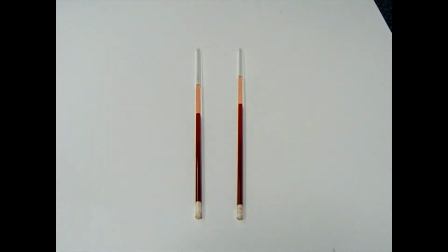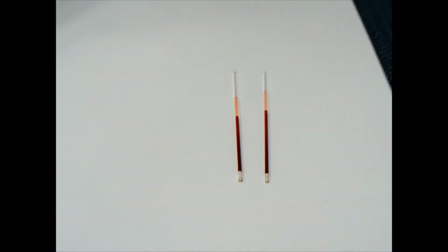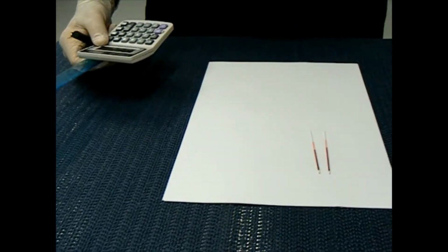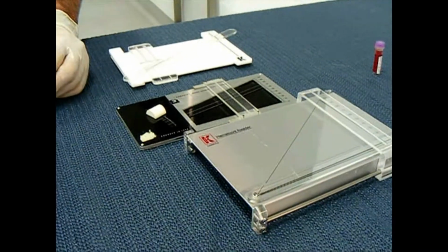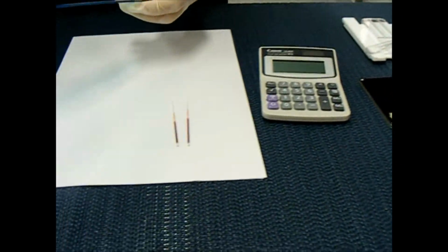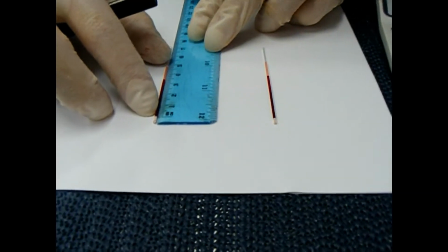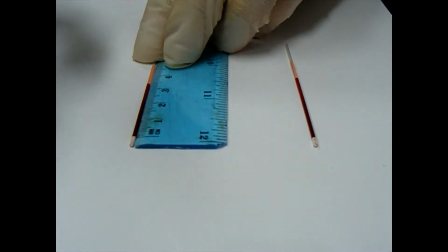We need to do a PCV in 2 ways. One is by using a ruler and a calculator. This is a manual method, so everyone needs to know how to do this way. We've also got some readers here, so you need to be able to use a reader. I'm going to show you how to do both those methods. Okay, so if we've got a capillary tube like this, you need to measure. Then there's 2 measurements you need to calculate.